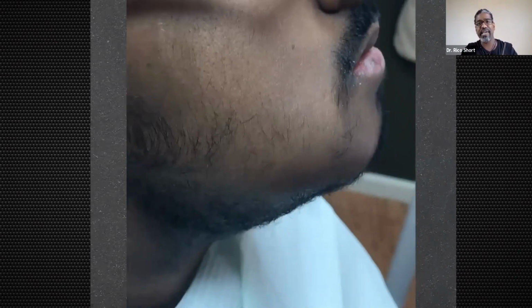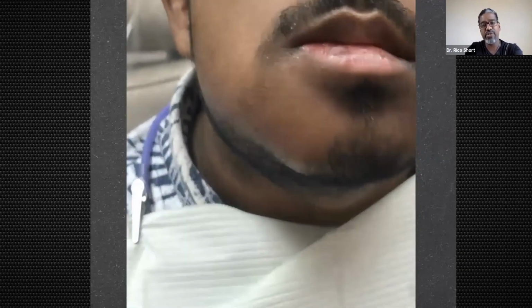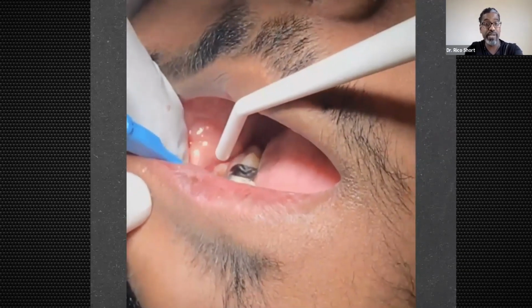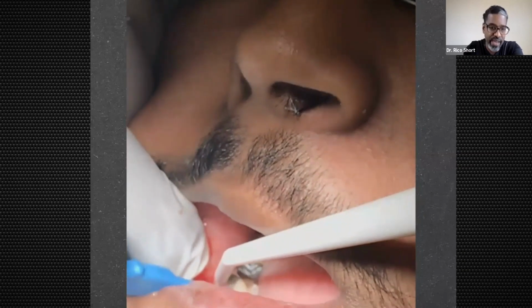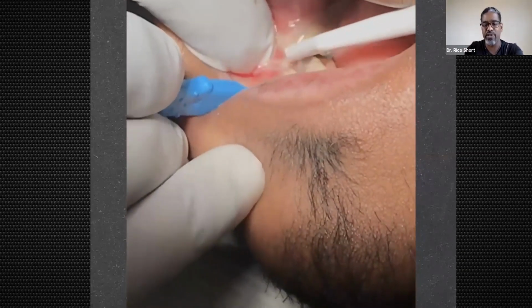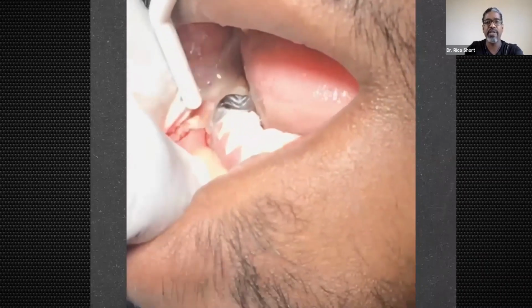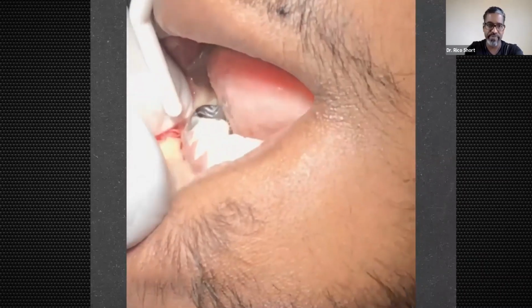But also, when you have a case just like I just showed you, you can't put a rubber dam on, especially if you're going to do an I&D. So this is the case that I was able to do an I&D on this gentleman because he was very swollen. He was actually getting ready to have an episode of Ludwig's angina. Obviously we can't put a rubber dam on. So I did an I&D on this gentleman. We got him feeling better and put him on some antibiotics. And we proceeded to do endodontic treatment on that lower first molar.